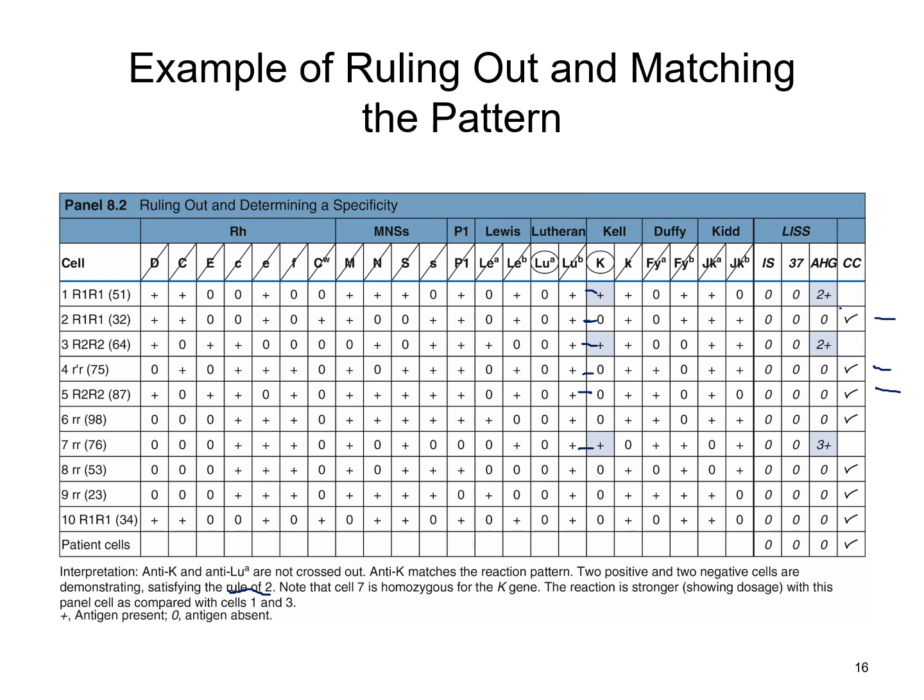And let's see, anything else that I need to, okay, showing dosage. It does mention it's showing dosage where we have that difference in reactivity of that 3 plus versus that 2 plus.